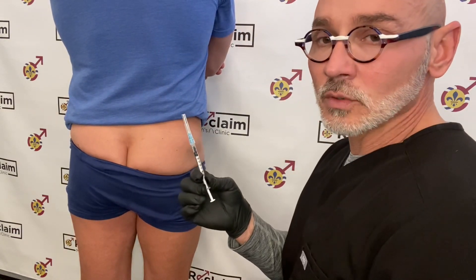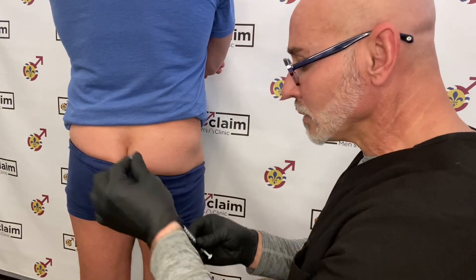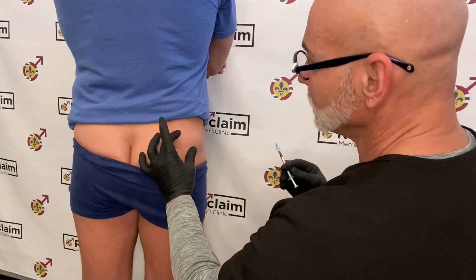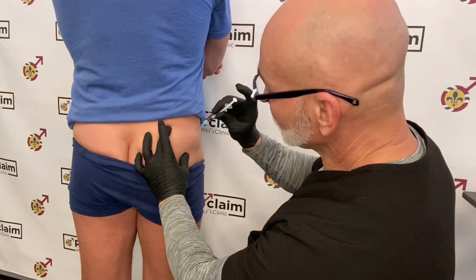Then take your syringe with testosterone in it, remove the cap, gently spread the skin apart, and then inject in a darting motion.